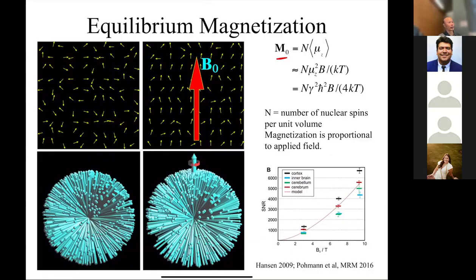So the only issue that comes with higher magnetic field is, if you go to a 7 Tesla magnet or a 10 Tesla magnet, you can get nauseous or dizzy. That's because as you're moving, if I just shake my head in a magnetic field, I'm creating currents in my head, right? I was once working at the back of a magnet, and I started feeling really weird because as I was moving my head near the magnet, I was causing currents in my brain. I don't know what part of my brain it was affecting, but it was affecting my brain. The other thing that can happen is, as you're putting RF energy in, you can cause burns. And so we have to regulate that.